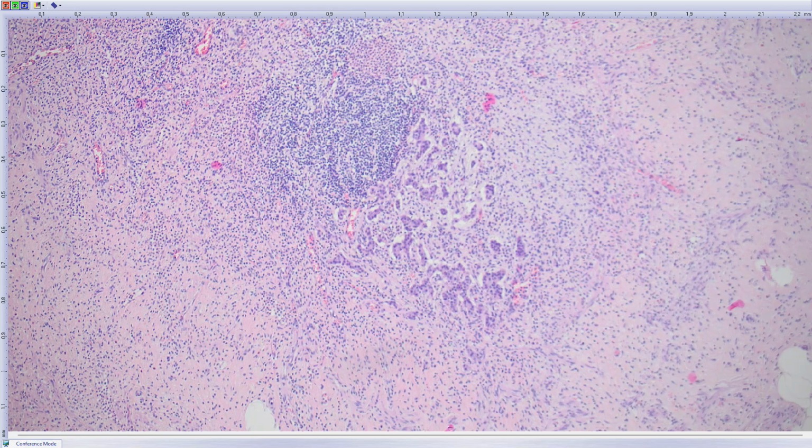arising in these cells. And it's amazing that this was already described by Pierre Masson in 1948, 1949. And he, just by H&E staining and silver staining, recognized that epithelial tumor-like carcinoid can arise from fibrous tissue. It is usually incipient, classical, very benign carcinoid in the tip of appendix. I'm sure if you repeat my staining in all fibrous appendicitis, you will find the same finding as I did.